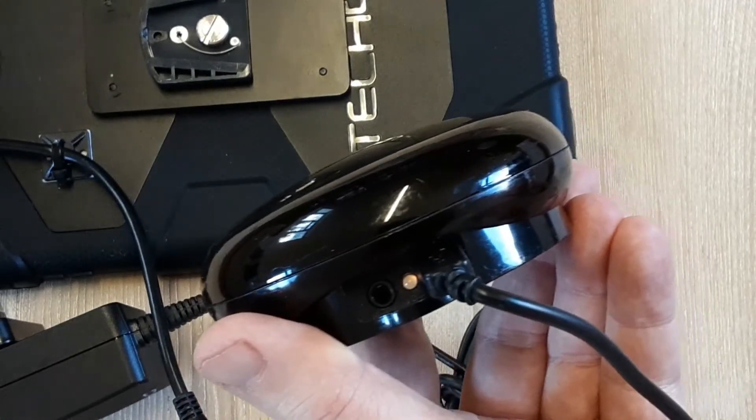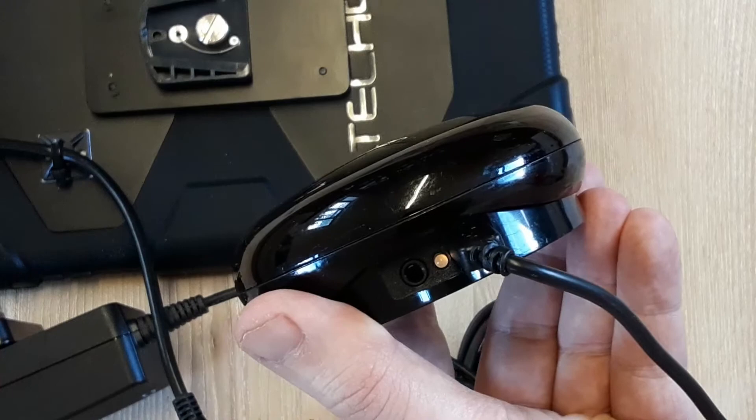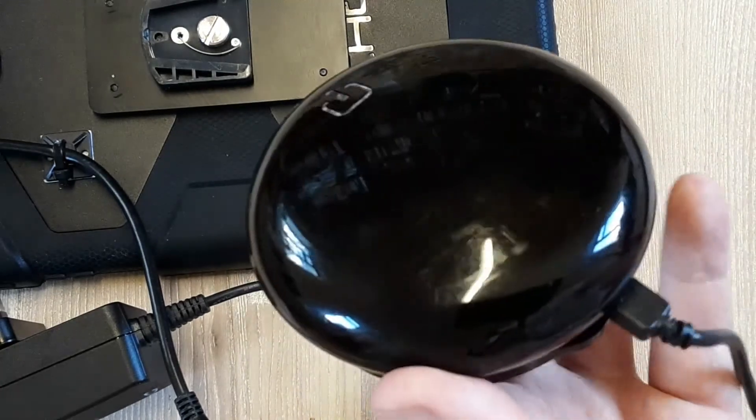When the cable is inserted into the hub, you will see an amber light shown. This indicates that the device is being charged.